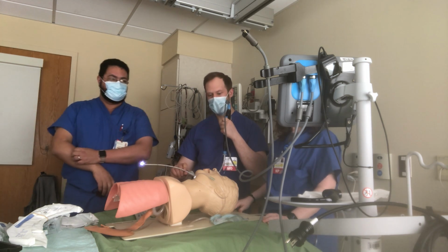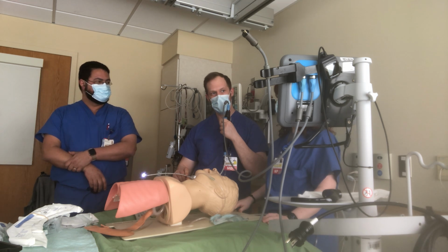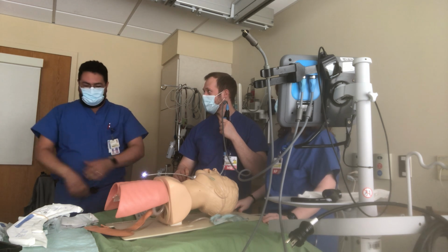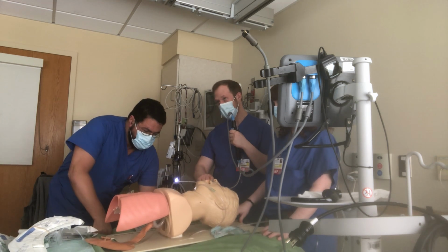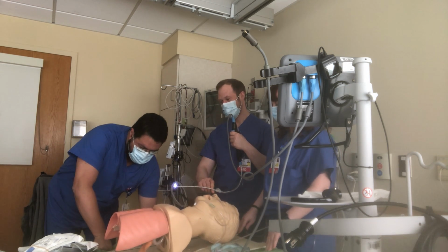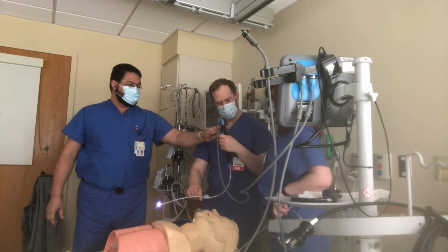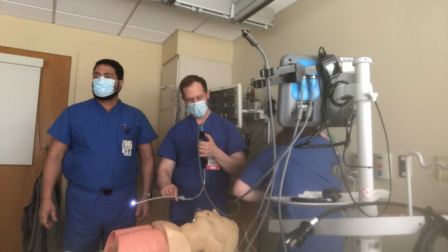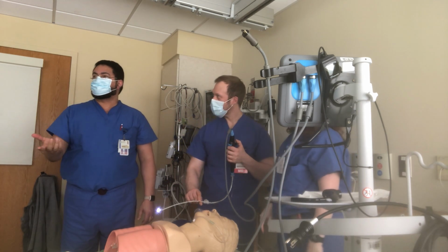All right, what else is left to do before you start? Before we start, we have to put the bed all the way down because your scope has to be straight, not taut. And then what else? What are we going to use here? So suction, if we're doing a bronch, but if we're doing intubation, you need oxygen.